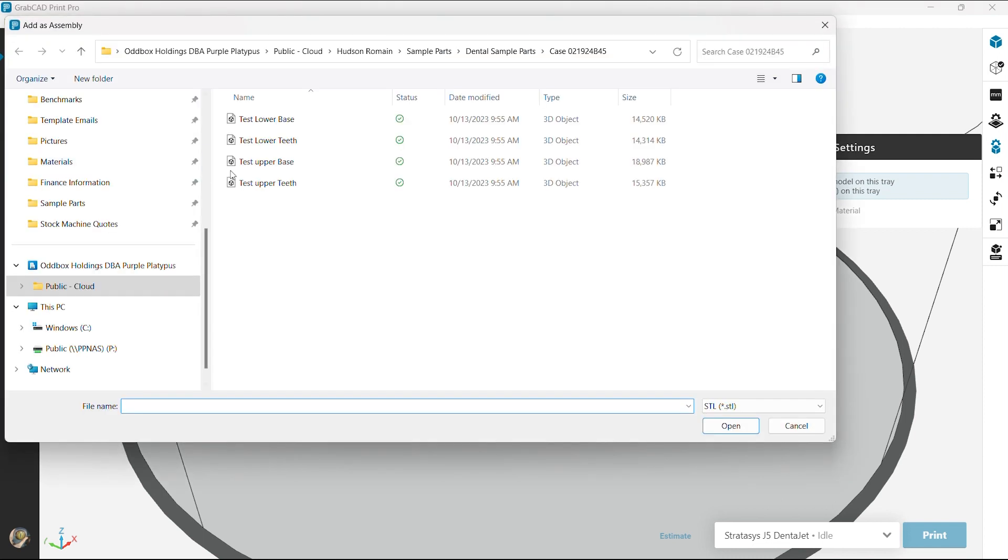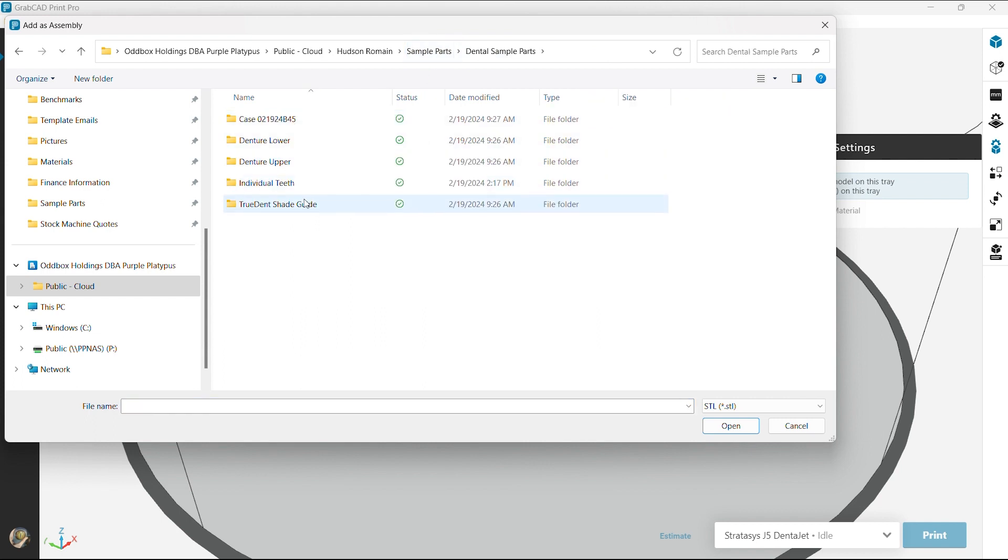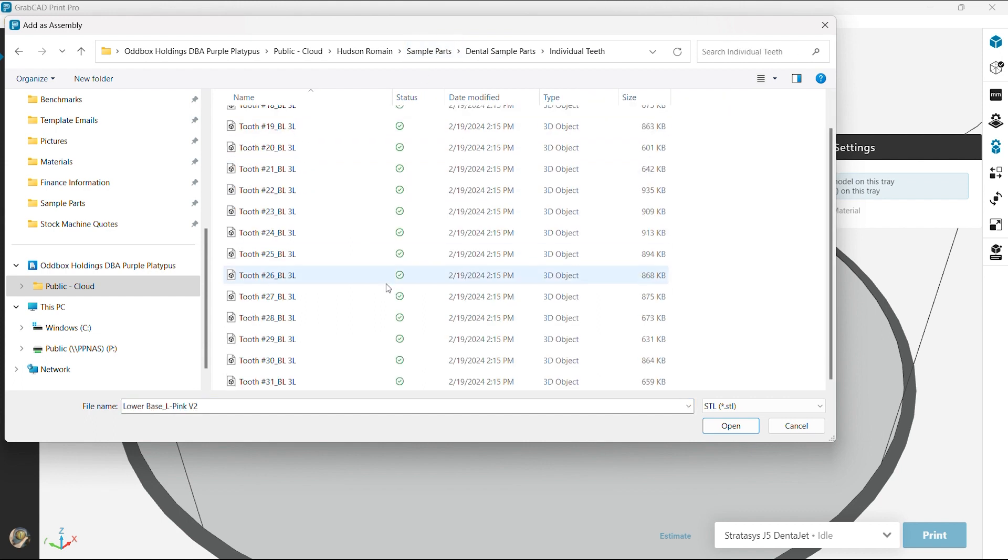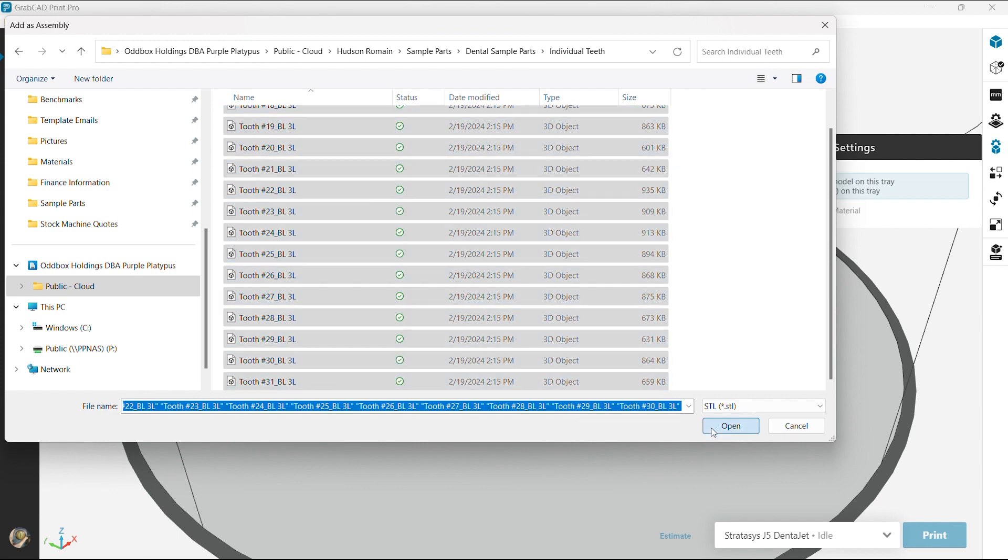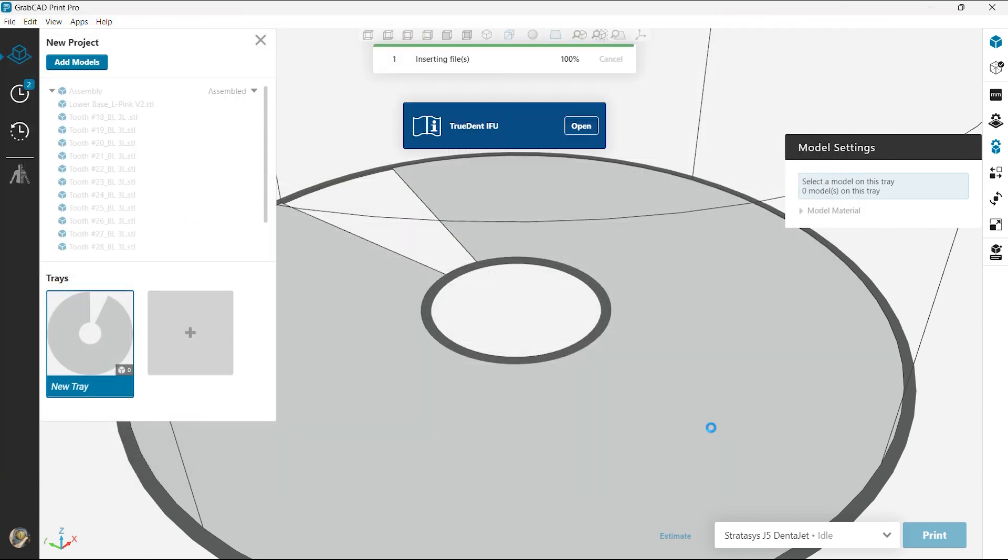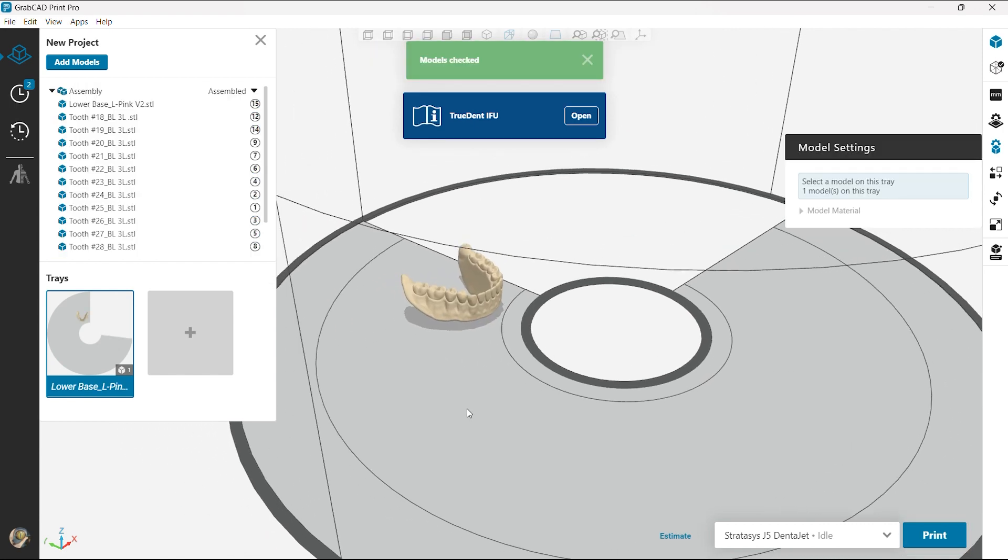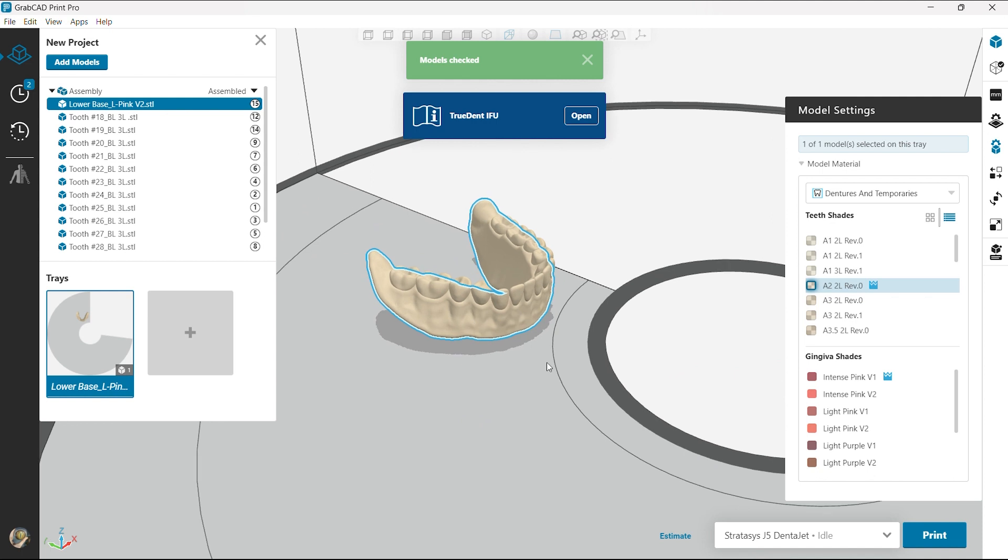So now I'm gonna bring in a different case. This time each individual tooth is called out. So in your CAD program you can export it as individual teeth, as a set of teeth. You can get as detailed as you want to. So here you see the base. I'm gonna select. On the left you can see all the different teeth are called out individually.